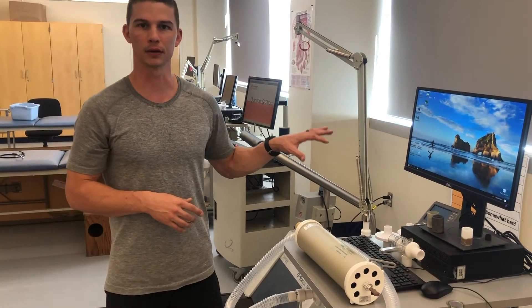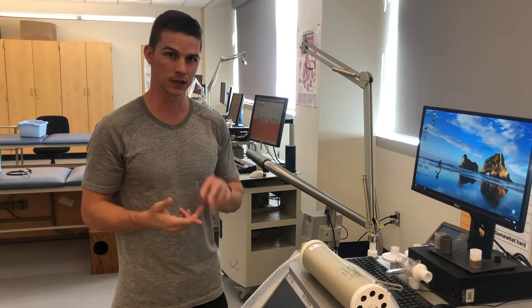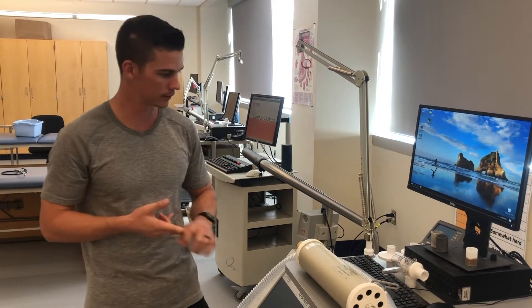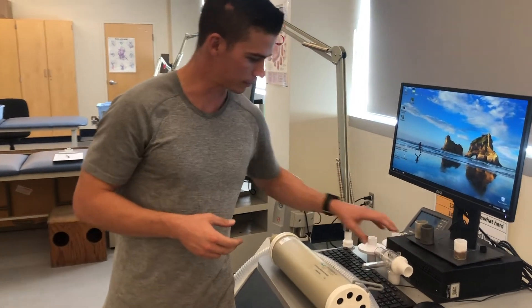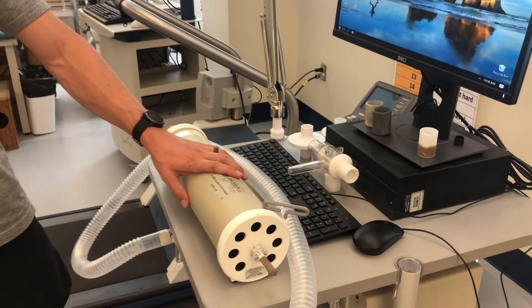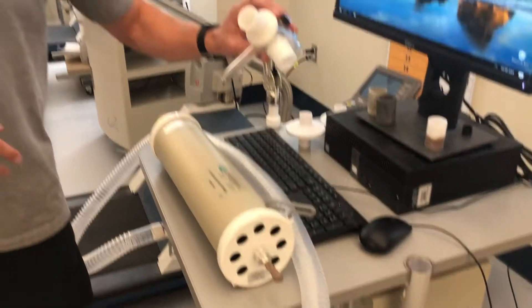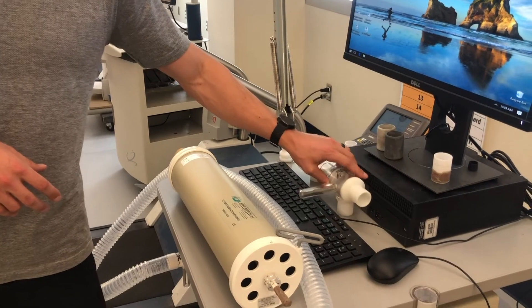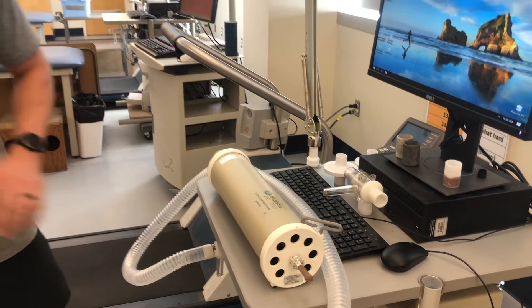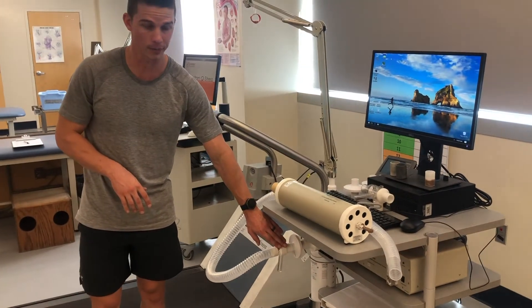I'm going to demo how to set up and calibrate the metabolic cart. You'll need this for VO2max testing and for indirect calorimetry. We have all of our pieces in place: a 3-liter syringe, a tube, and a 3-way valve that attaches to a mouthpiece. The other end of the tube is connected to the bottom of the metabolic cart.